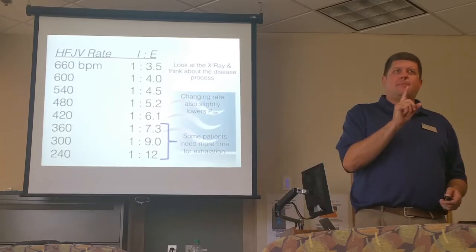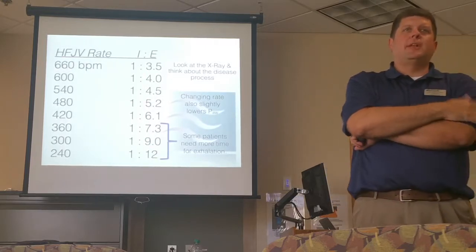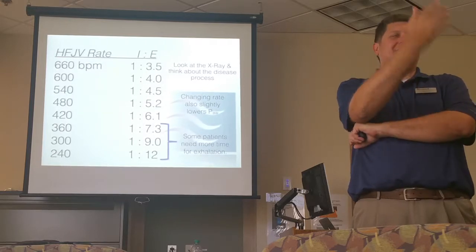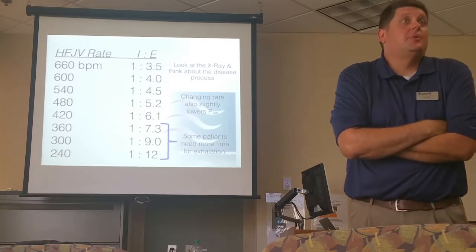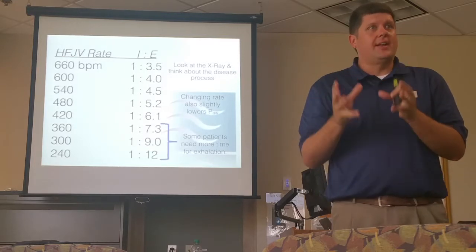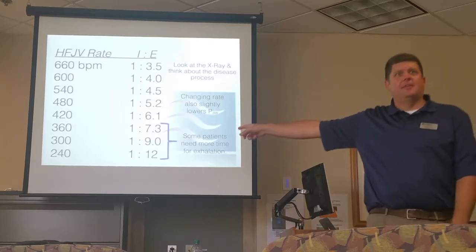Yes, but I'm also going to say no. Here's why. If I've been at 420 for 2 days, 3 days. I'm saying in the old days, we never touched the rate. Right. But if I've been on 420 for 2 days, 3 days, and my X-ray today still looks as overinflated as it did 2 days ago, then that's all the evidence I need to go lower.